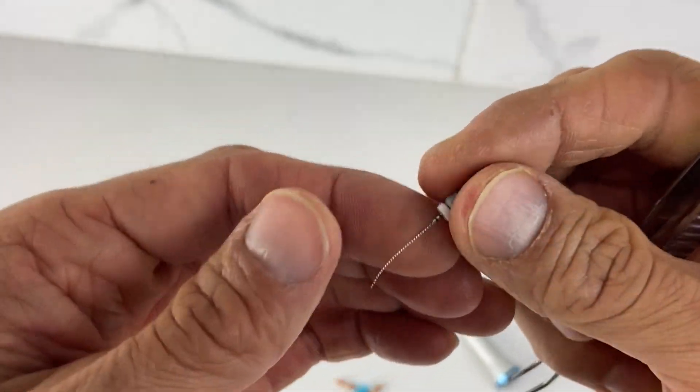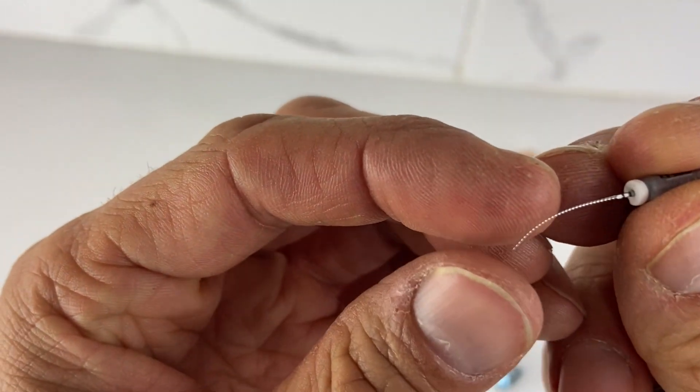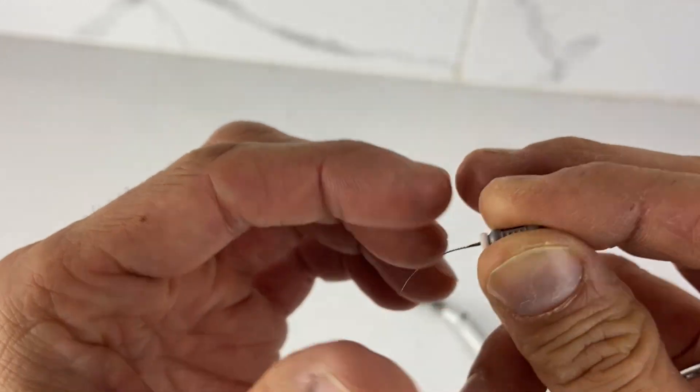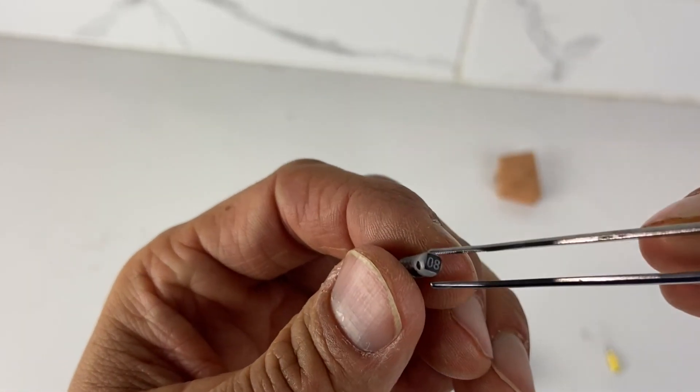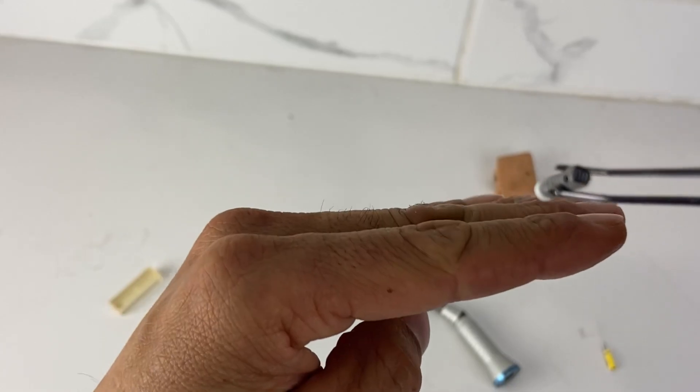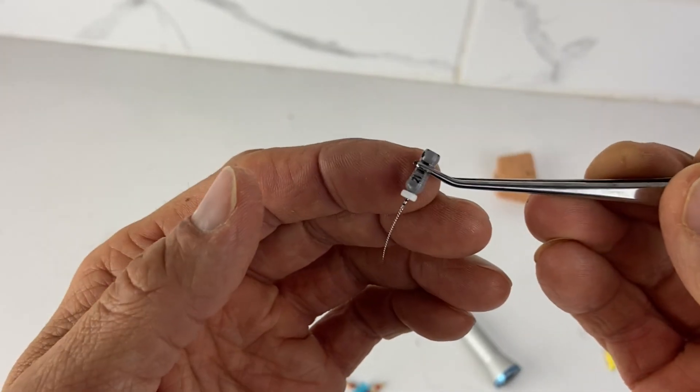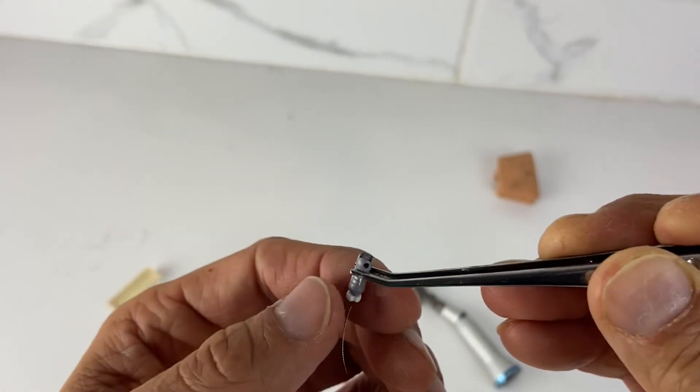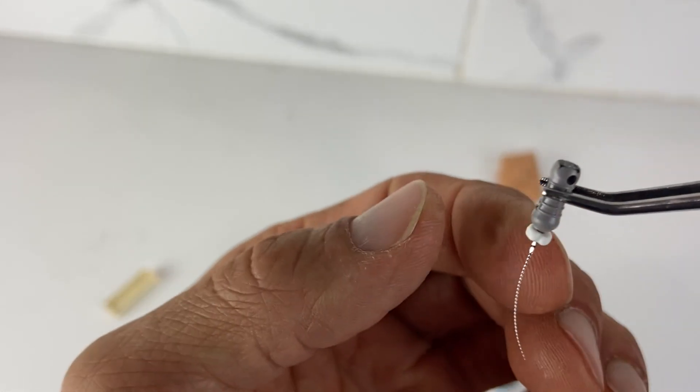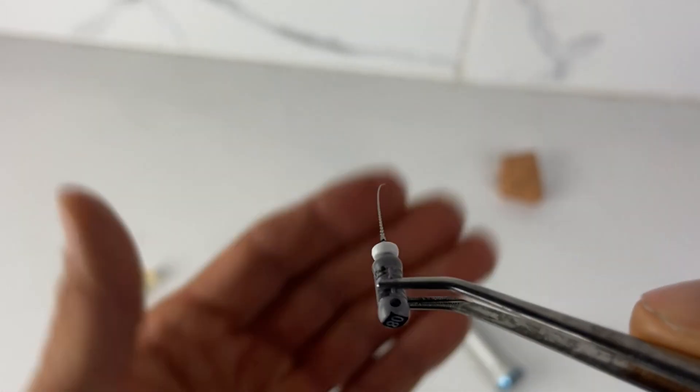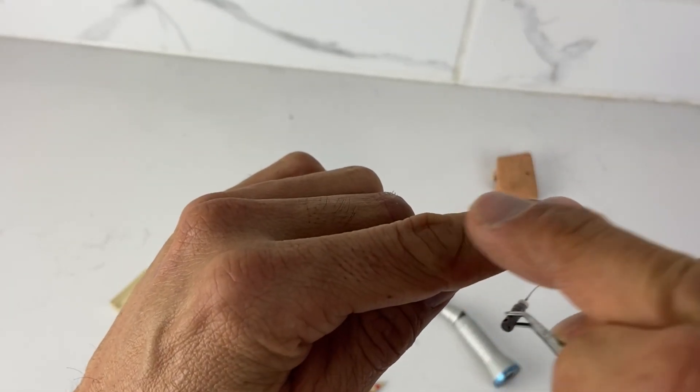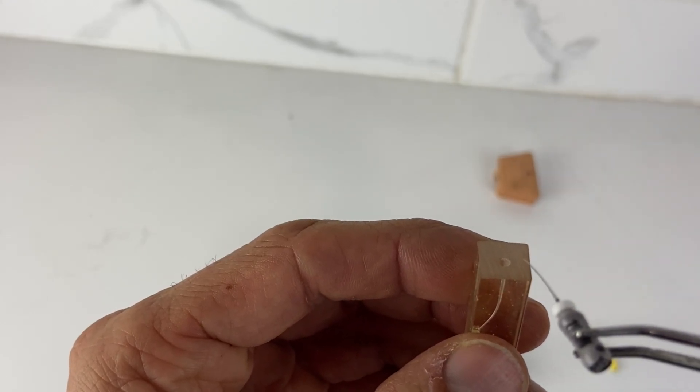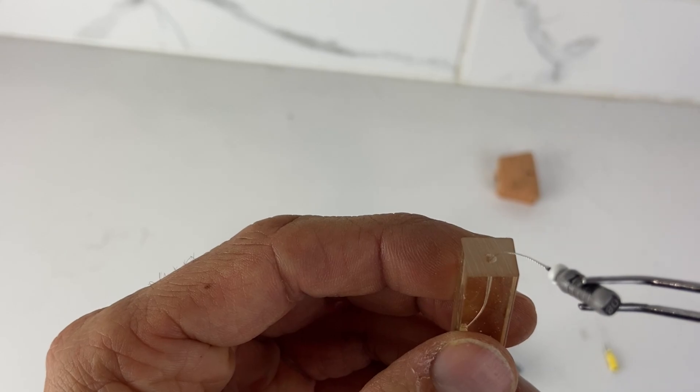Now the next stage is I'm actually going to put not a little J hook, I'll put a banana curve, something that's easily straightened when it goes in the canal. And the reason why I do this is because as I approach, if the tooth is right here, I'll have the curve of the file. You can adjust the unidirectional stuff. What the curve is doing is it's going along the axis of the tooth or the canal you're trying to get into.